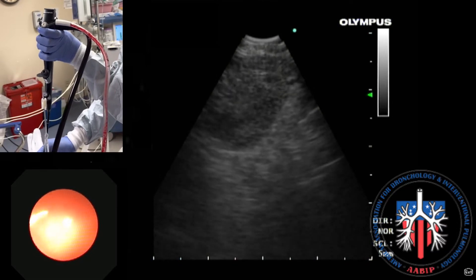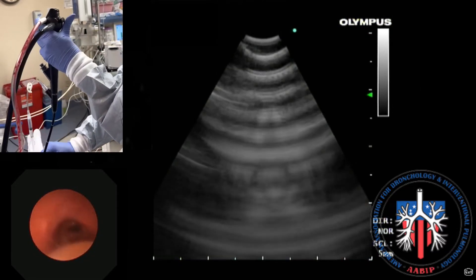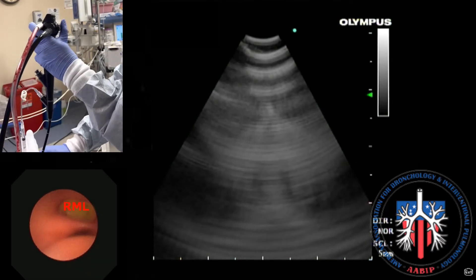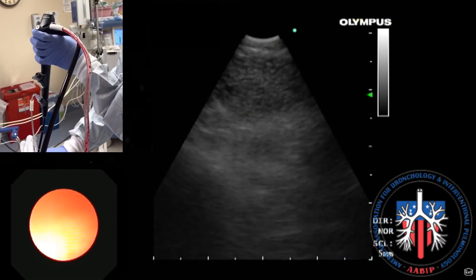Station 7 extends distally, starting from the takeoff of the right middle lobe and going all the way approximately toward the main carina.